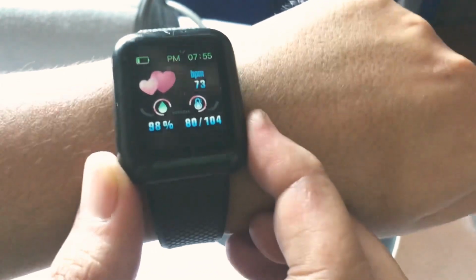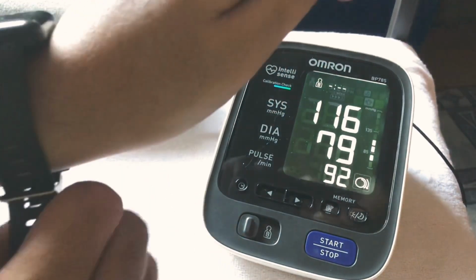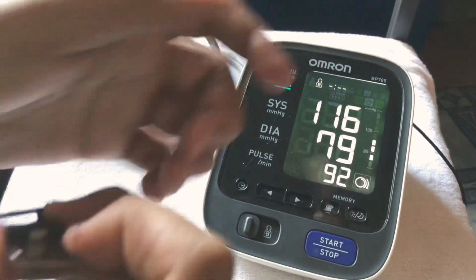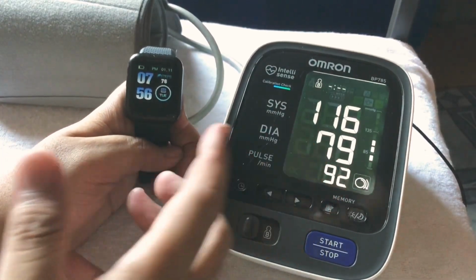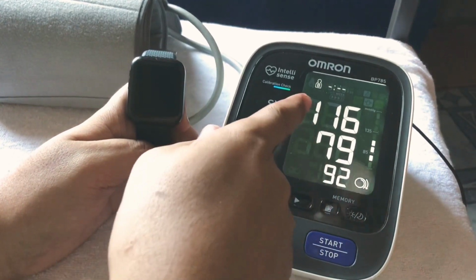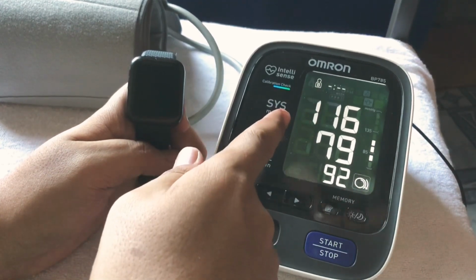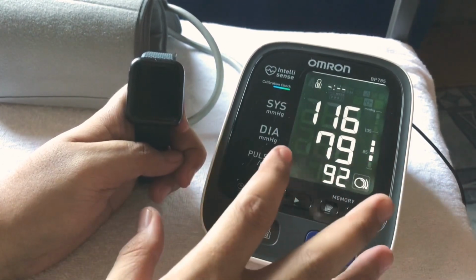Alright guys, so this is now the result. It's 104/80. So it's somewhat similar, especially, guys, the upper number is what we call the systolic blood pressure, and the lower part is the diastolic blood pressure.